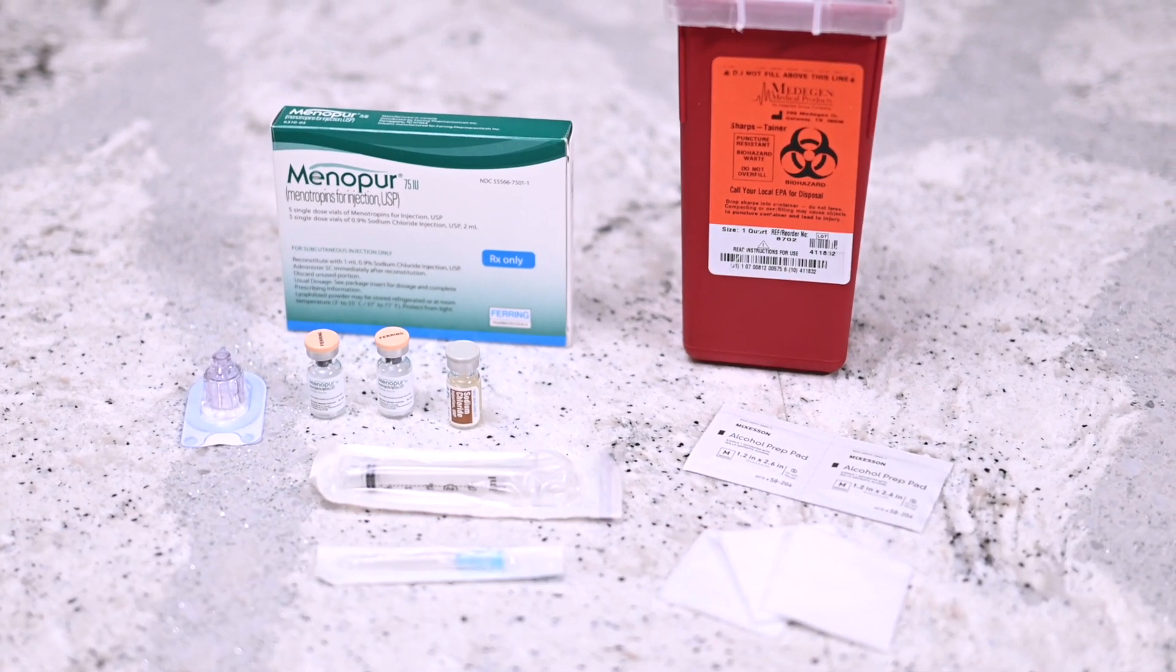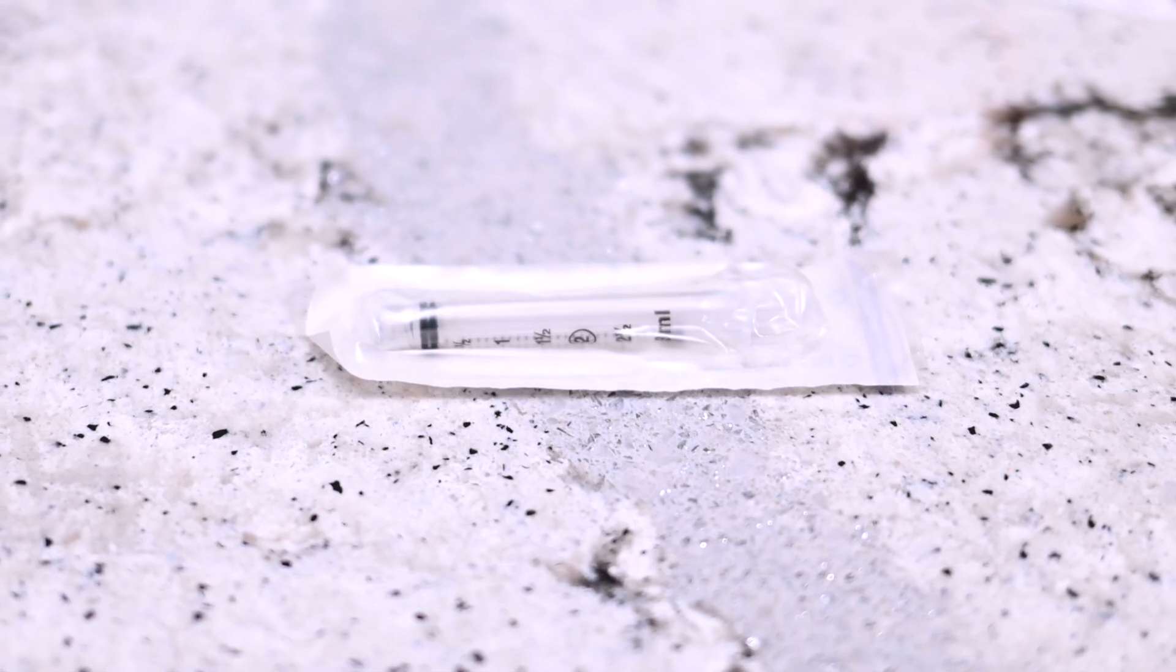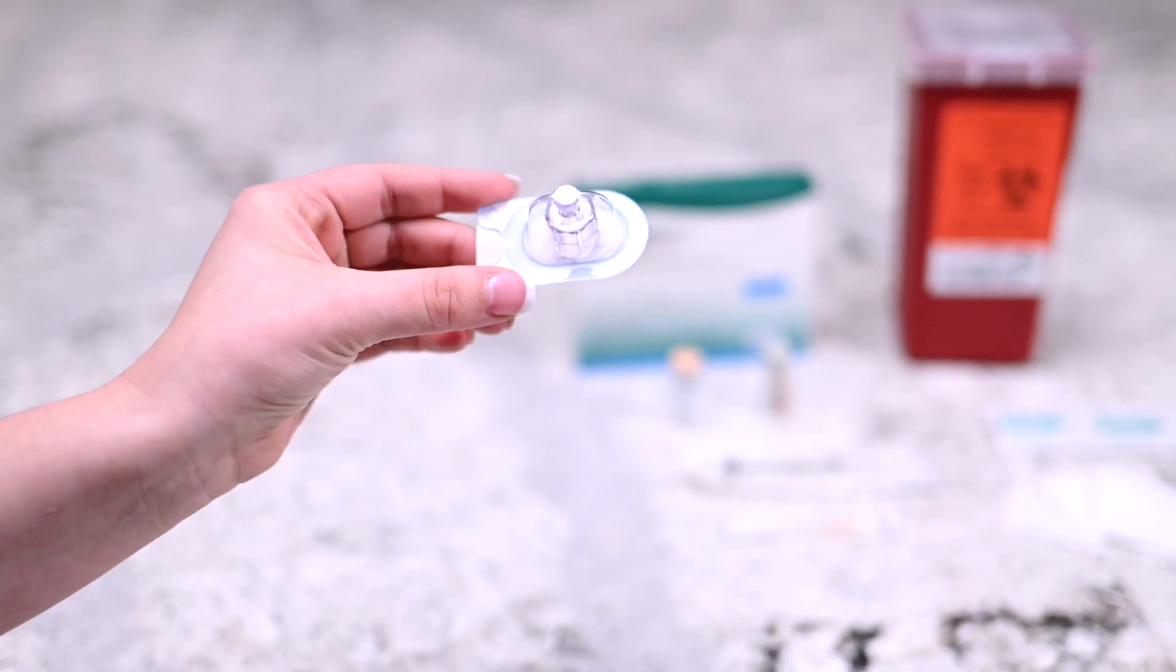You will need the following: two vials of Menopur powder, one vial of sterile diluent, syringe, needle, q-cap, alcohol prep wipe, gauze, and sharps container.